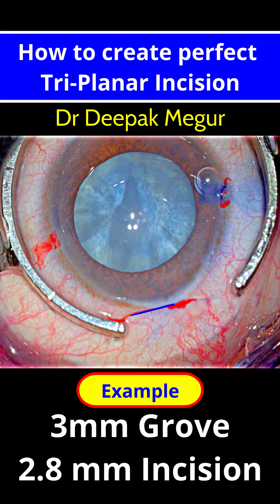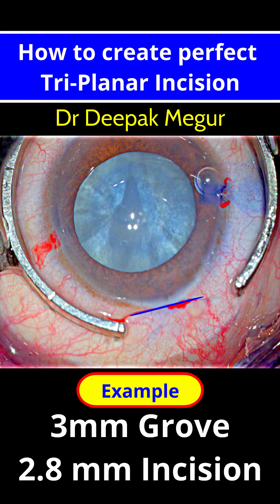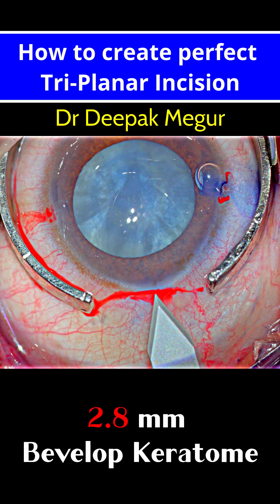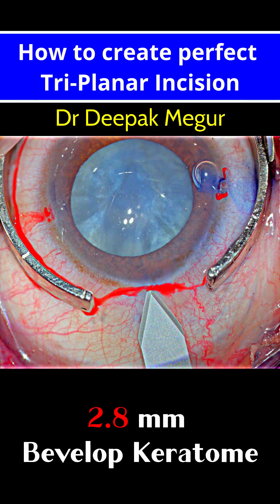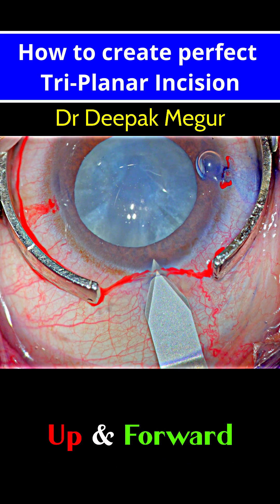For example, a 3 mm groove for a 2.8 mm incision. The 2.8 mm bevel-up keratome is placed in the groove first, and the blade is then moved up and forward.